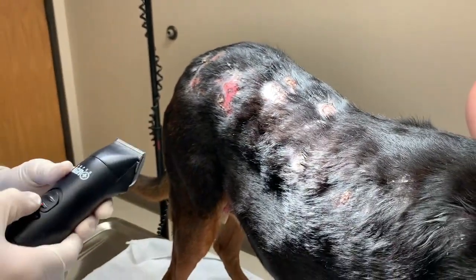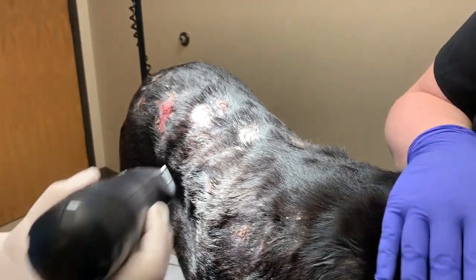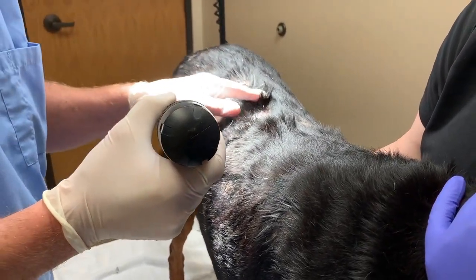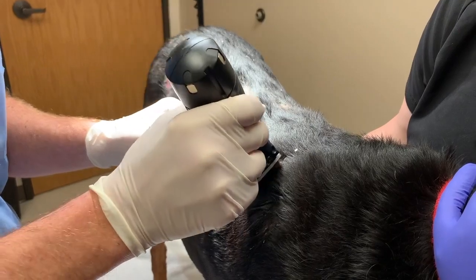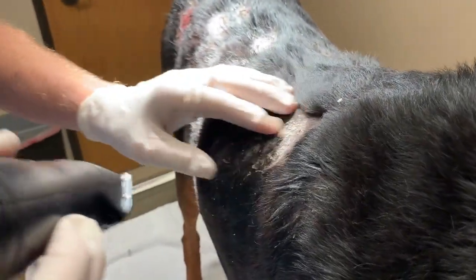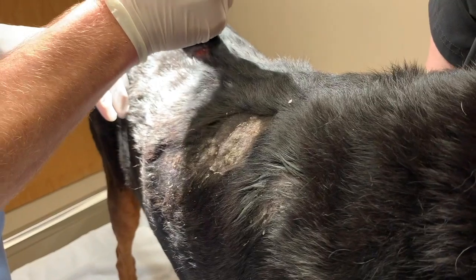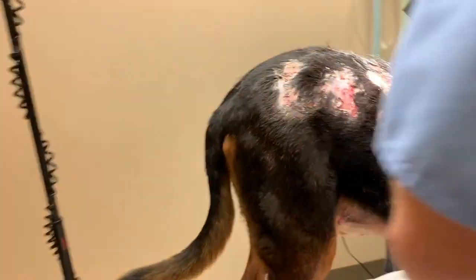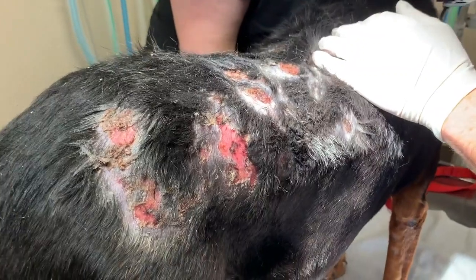We're going to clip up a few areas that we want to biopsy first, and we want to shave it pretty lightly. I don't want to go through a thick crust or ulcer. So I'm going to clip over here by this lesion, clipping kind of gently, leaving some of the crust intact with the biopsy there — leaving a biopsy site on the margin of one of these older lesions, and looking for another good spot to biopsy, maybe here.